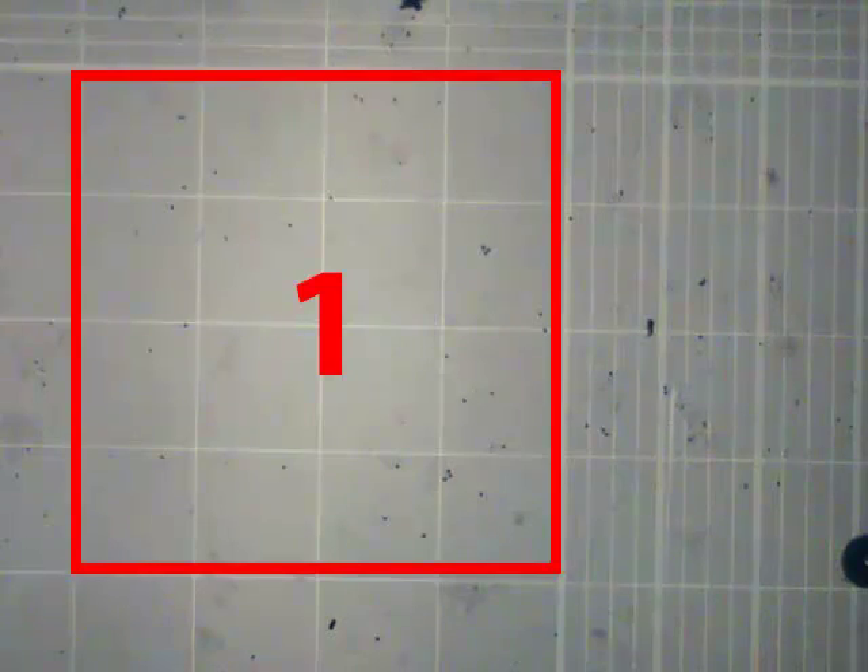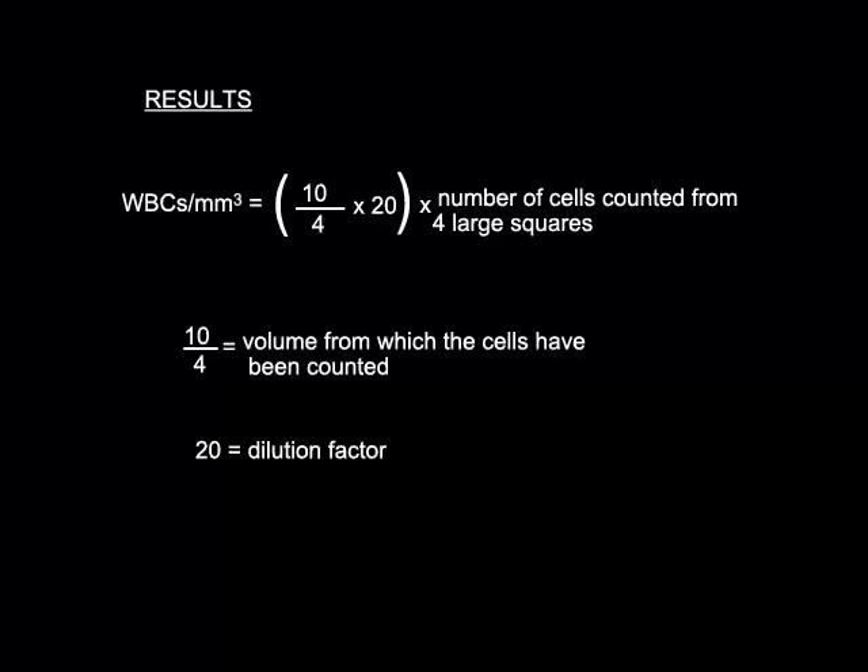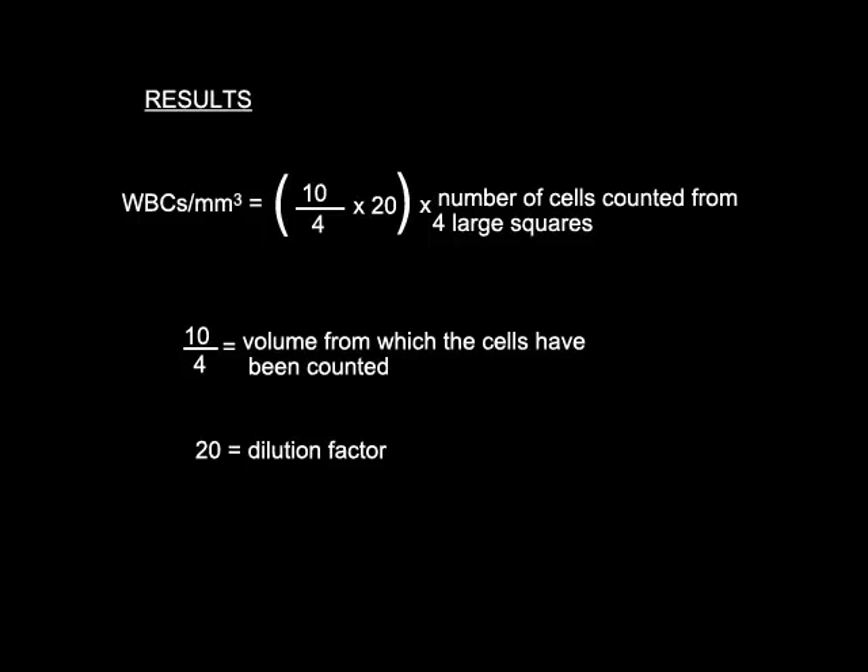The white blood cells in the counting squares are counted, and the number is estimated as shown.